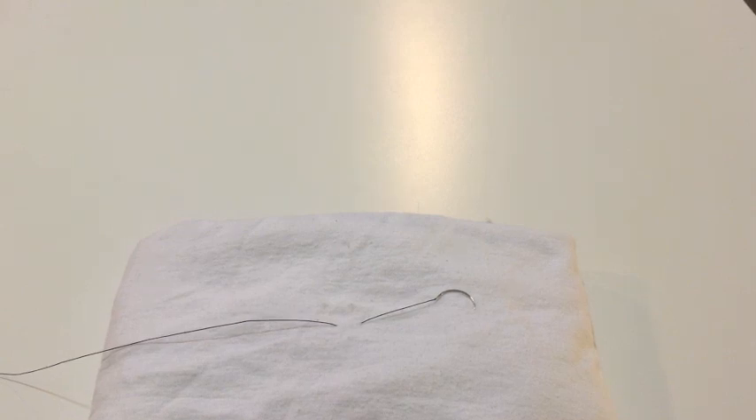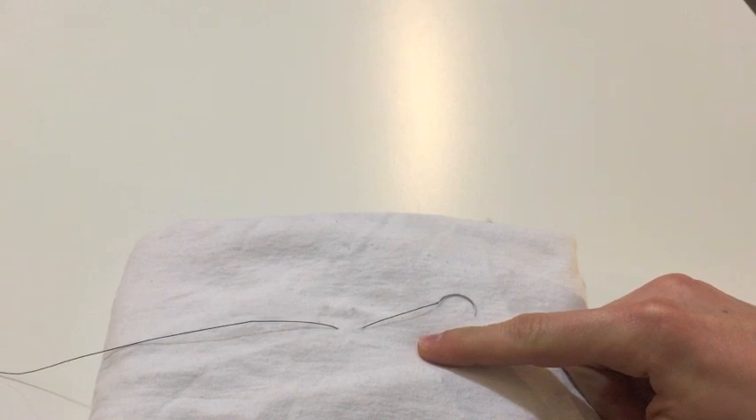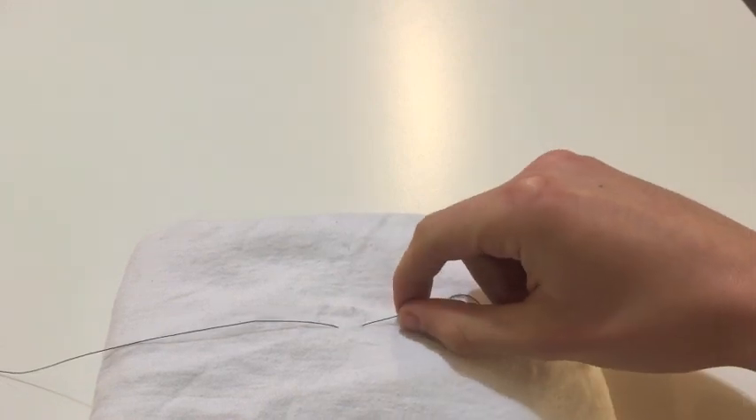Here, I've changed the perspective of the camera to be my view looking down at my suture that I've passed through my rolled-up t-shirt. Hopefully, this will make it easier to follow along.